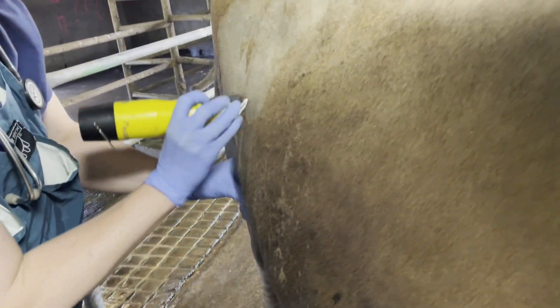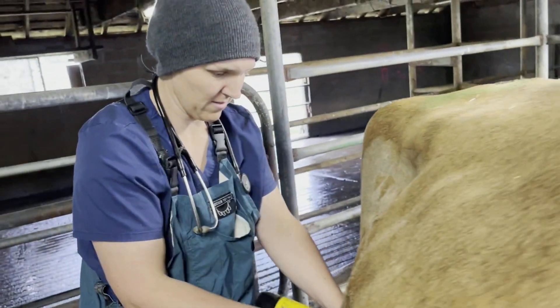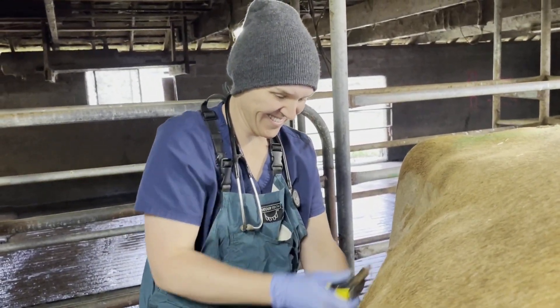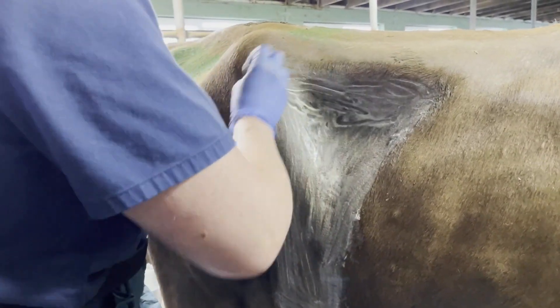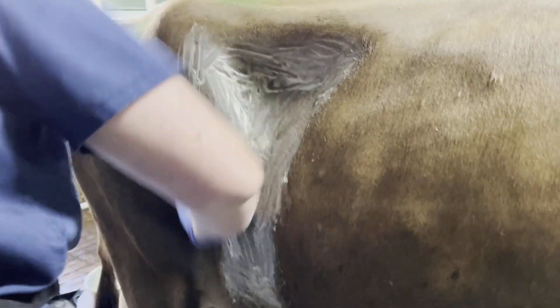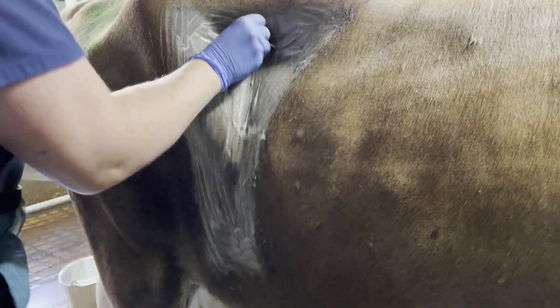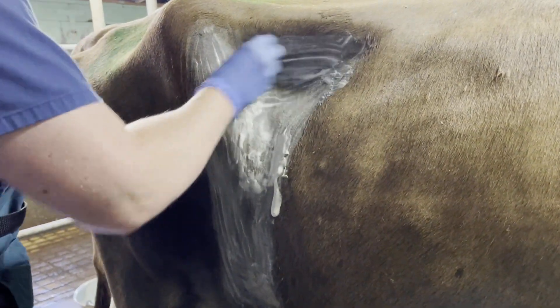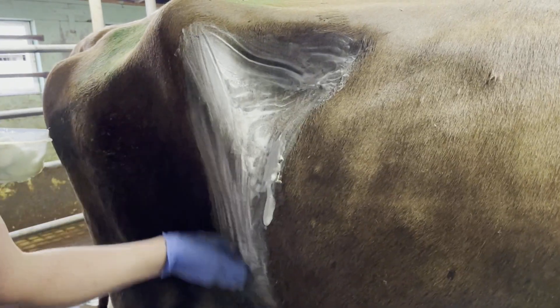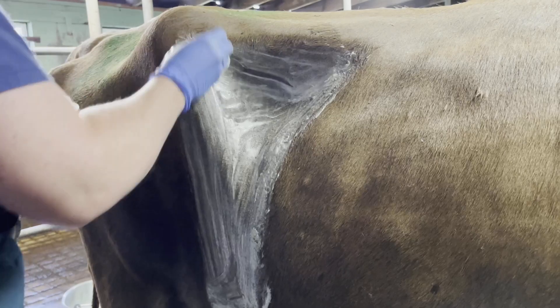She'll get in the area. The cow won't feel anything — Tracy's a professional. Sanitizing. Surgical scrub is a technical term. And I just gave her a little bit of a sedative with some xylazine, just to take the edge off so she feels a little bit more comfortable with everything.